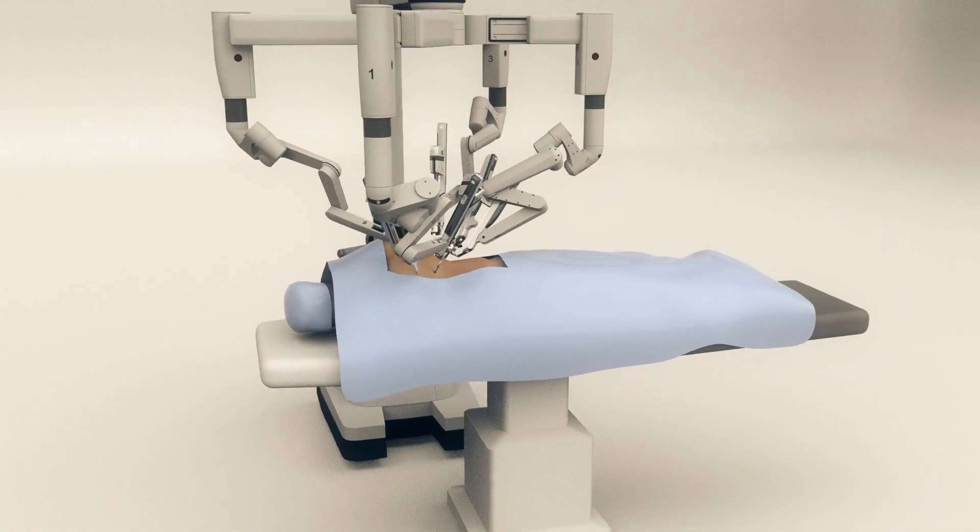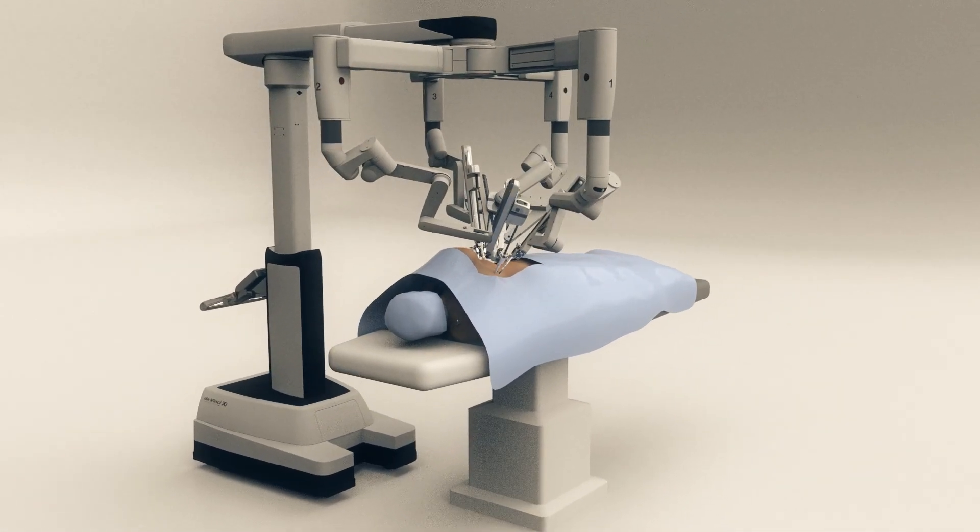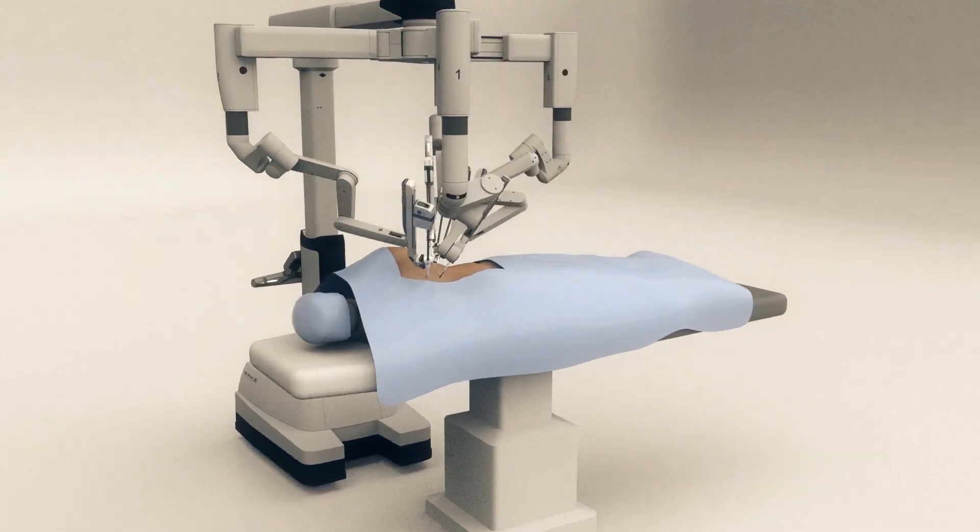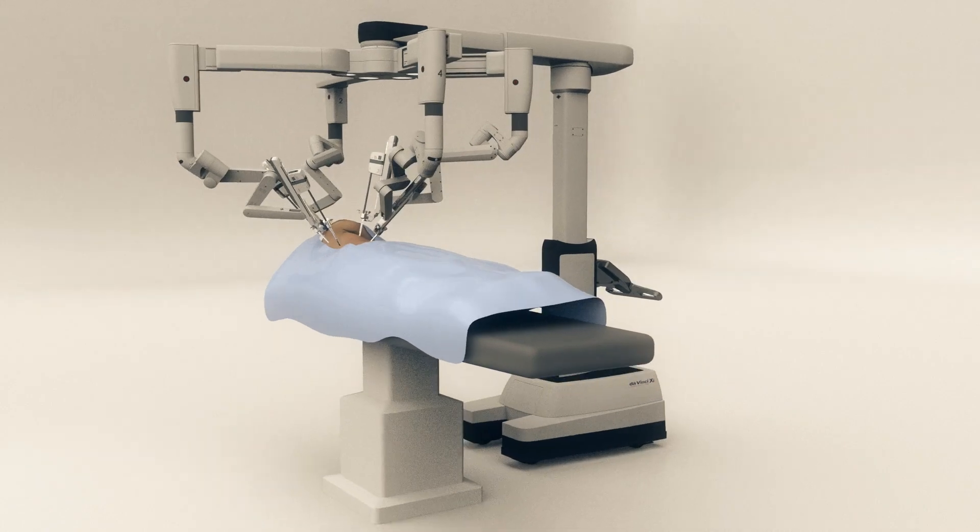A surgical robot, also called da Vinci, has four arms. Three of the arms hold instruments and one holds a camera that provides a magnified three-dimensional view inside the body.